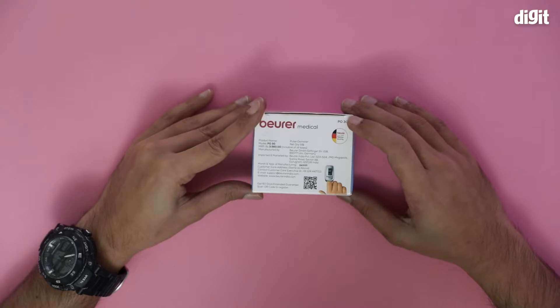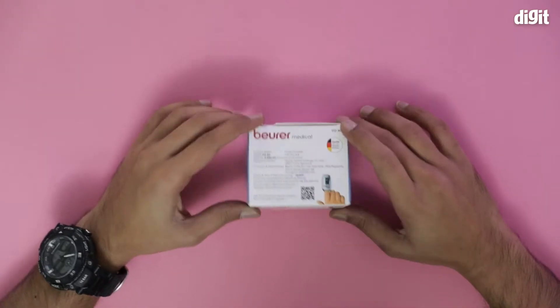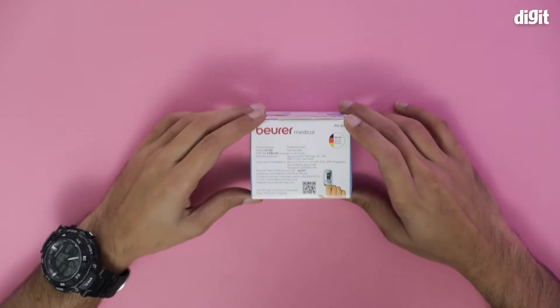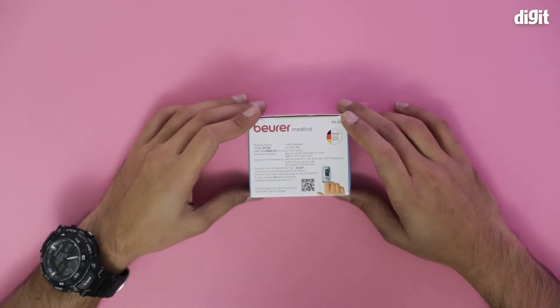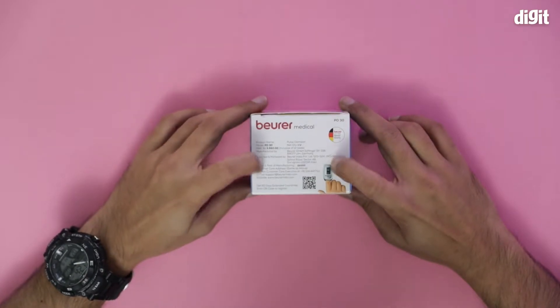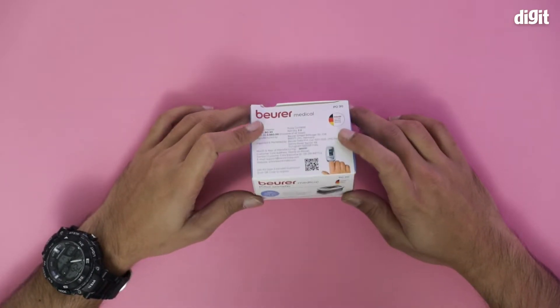Hello and welcome to the unboxing of the Bureau Medical pulse oximeter. This pulse oximeter is developed and manufactured by Bureau Medical, which is a very popular pharmaceutical company from Germany. The packaging mostly contains manufacturing information, unfortunately.